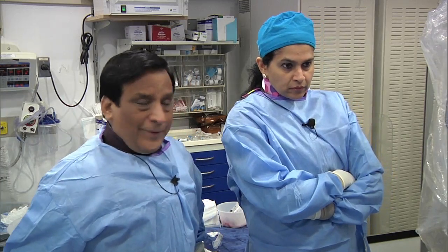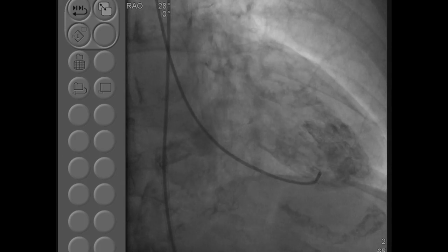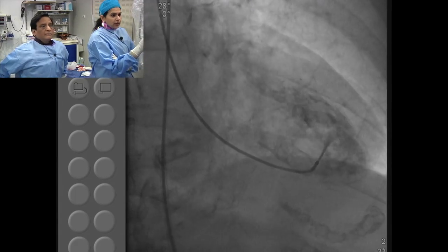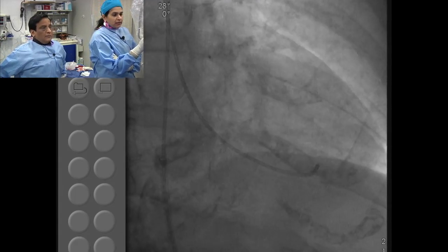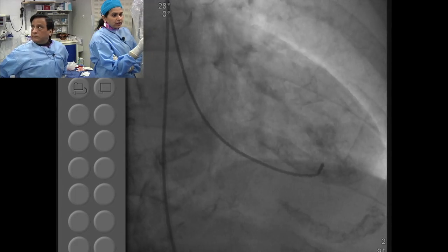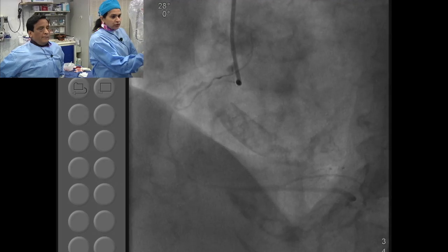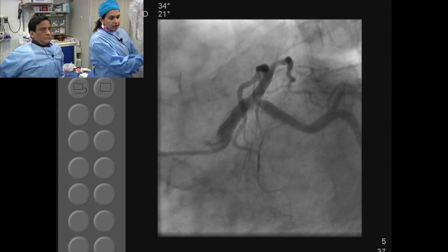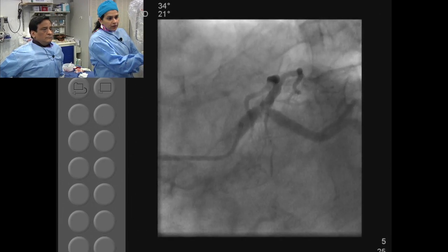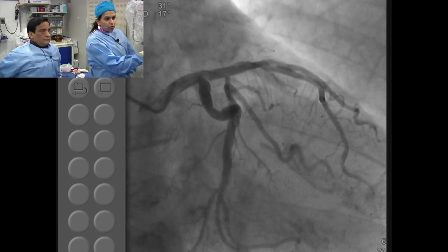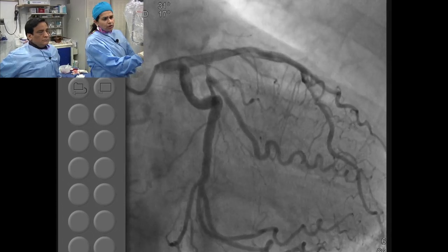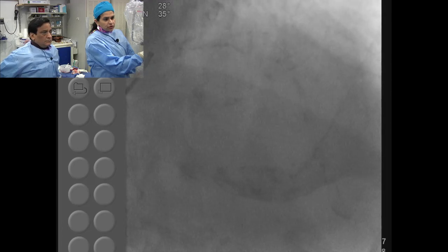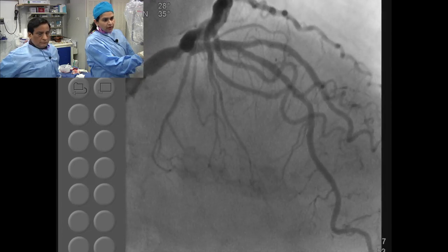Anu has taken a baseline shot. Her EDP was about 20, she has a normal LV gram, and importantly on the LV gram she has tram-track calcium from distal left main extending into the circumflex and also into the LAD. She has a non-obstructive right coronary artery. Her distal left main is 90 to 95 percent stenosis bifurcating into the LAD and circumflex. Both are large-size vessels. There is a moderate 50-60 percent in the mid LAD and a bifurcating LAD-diagonal which is disease-free.